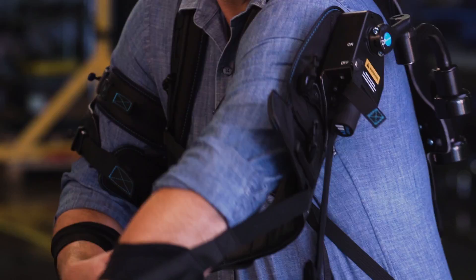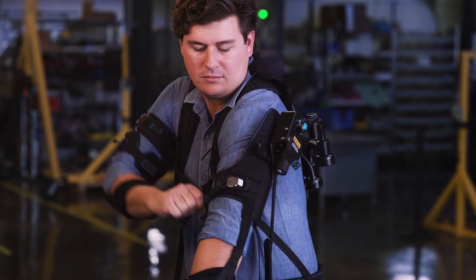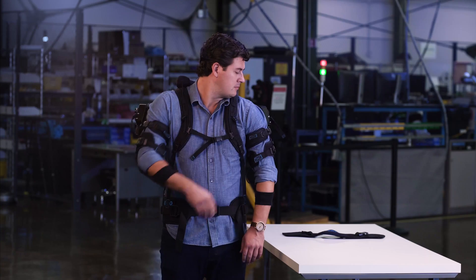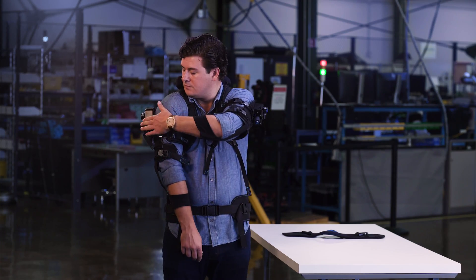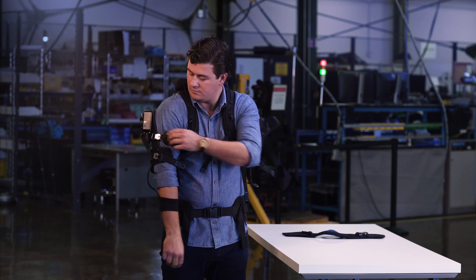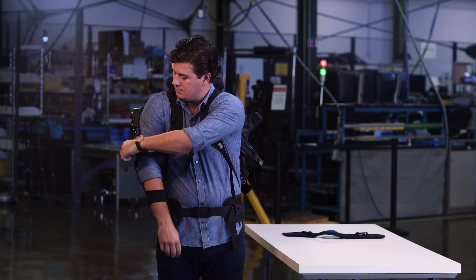Repeat this with the other arm cuff. When you take off your ExoVest, make sure the actuators are turned off. It's easiest to remove your ExoVest in the reverse order, ending with the hip belt and shoulder straps.